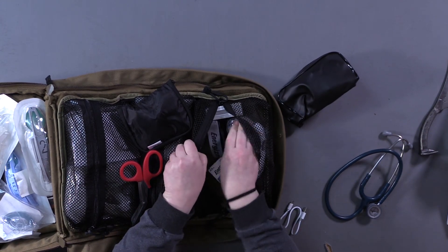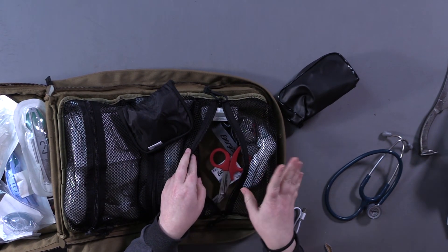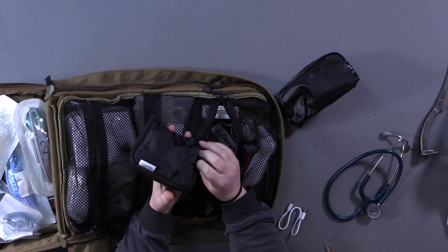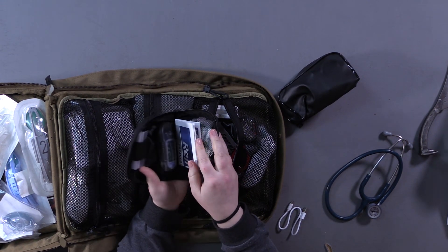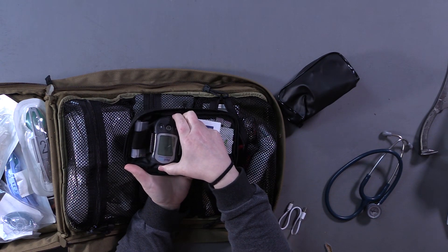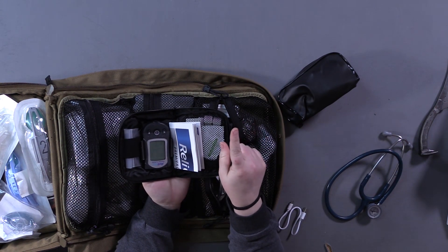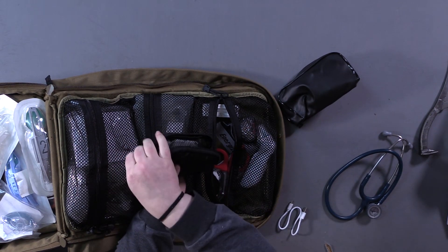We've got a headlamp so that you can be hands-free, some shears to cut clothes or anything else that needs to happen, and a glucose monitoring blood sugar meter. Inside we've got the monitor itself, testing strips, lancets, and alcohol pads. These are single-use lancets so you can test multiple people if needed.